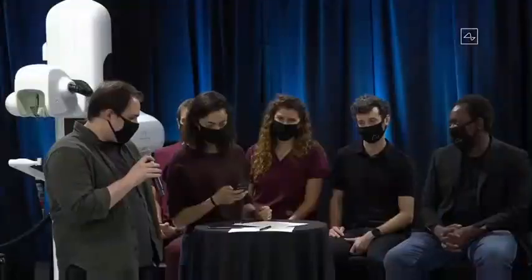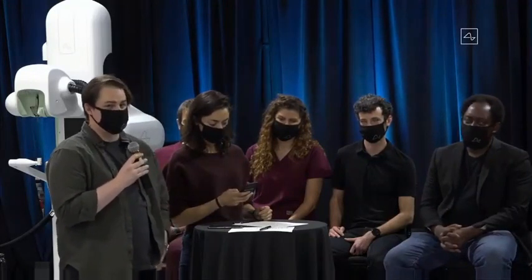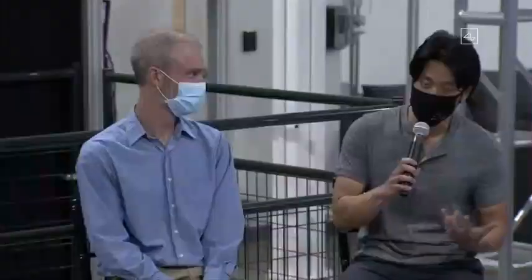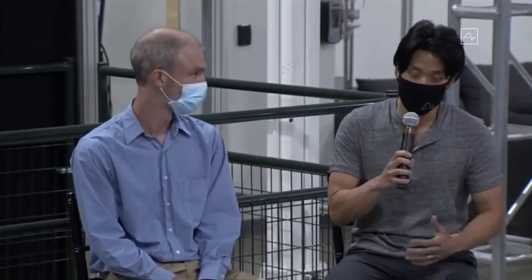Cool. So Twitter asks, how does the implant system fare against various disturbances from the outside, like electrical, magnetic, Wi-Fi, radio? Yeah, so the current version of the implant that we have is using Bluetooth low energy radio. So similar to any Bluetooth devices that are out there, they are able to coexist with other devices that are using and sharing our same spectrum in 2.4 gigahertz. Obviously, as you imagine, when you go to concerts or there's just a lot of people, the signal quality does degrade because it is a pretty congested spectrum.